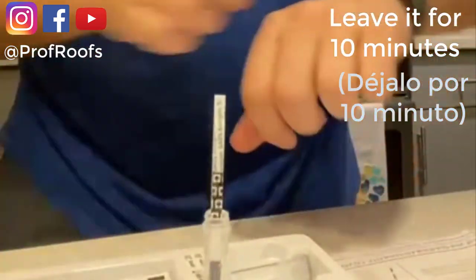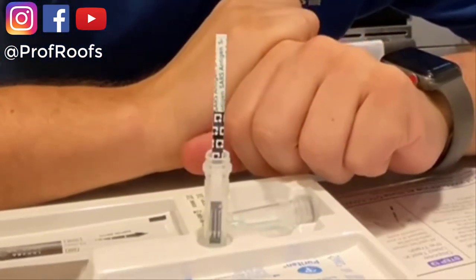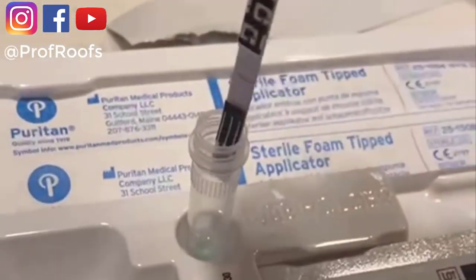Leave it for 10 minutes. 10 minute timer. Okay, 10 minutes and counting. All right, 10 minutos. Okay, lo vamos a sacar, take it out here, lo vamos a poner acá, we'll put it here.